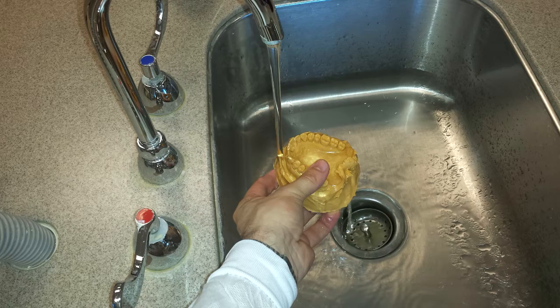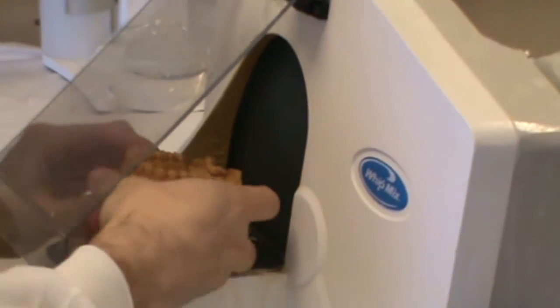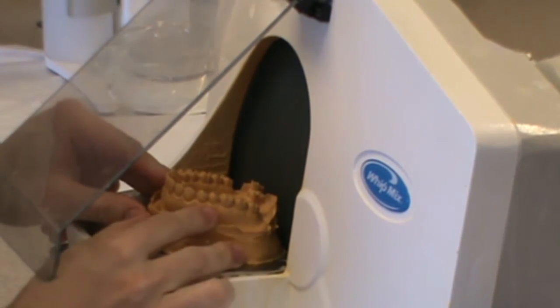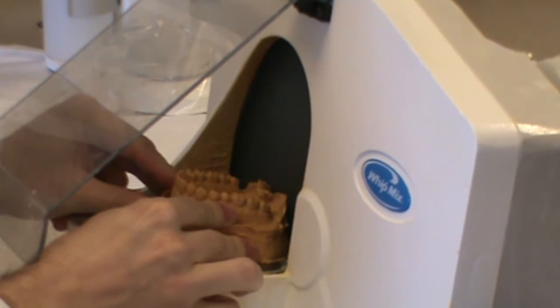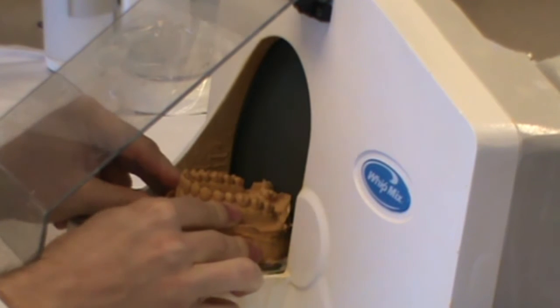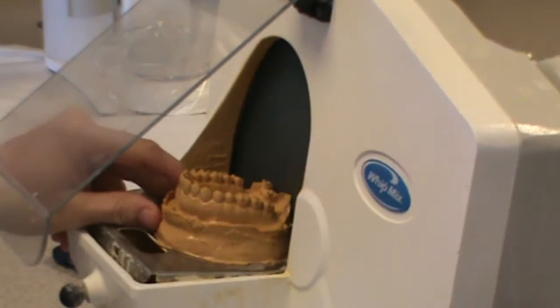We're going to go ahead and trim our cast. Before you do that, you need to make sure you get your cast wet, otherwise the stone will stick everywhere and distort the surface of your cast. So make sure you get it wet. When I start trimming the cast, I always trim the posterior first and make a nice flat area on the posterior. That will give me an area that I can set the cast to trim other areas.